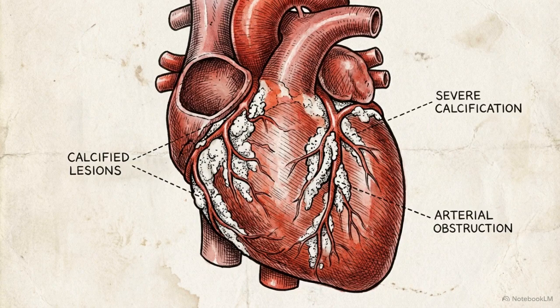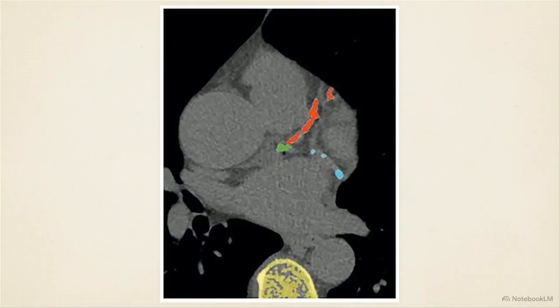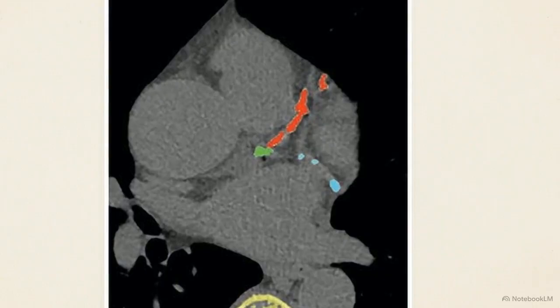Coronary artery calcification, or CAC, is the strongest imaging predictor of future cardiovascular events and mortality. CAC represents the burden of calcified atherosclerotic plaque within the vessel walls. Traditional Agatston scoring relies on ECG-gated scans to freeze cardiac motion, but non-gated chest CTs yield diagnostically equivalent information. One constraint: non-gated scans tend to underestimate CAC scores by approximately 5% compared to gated studies.